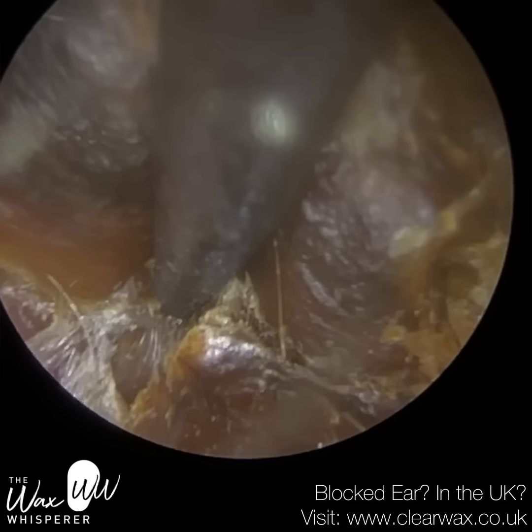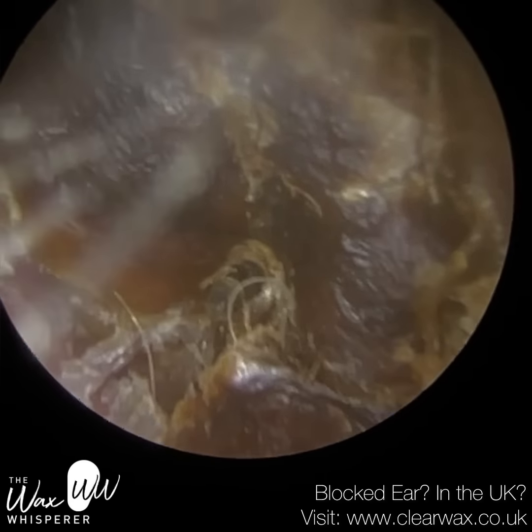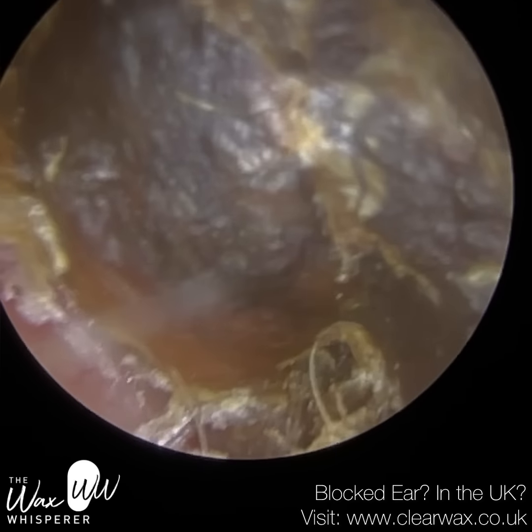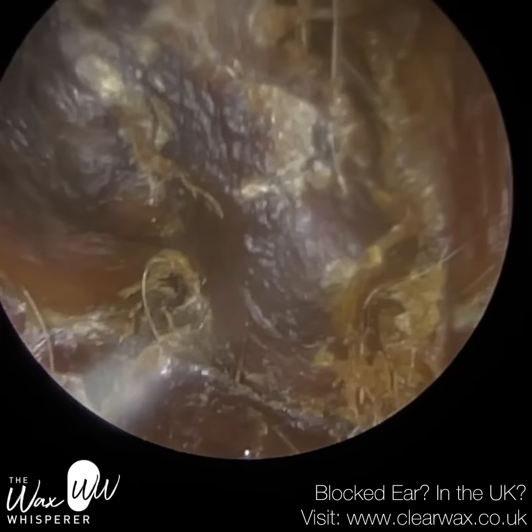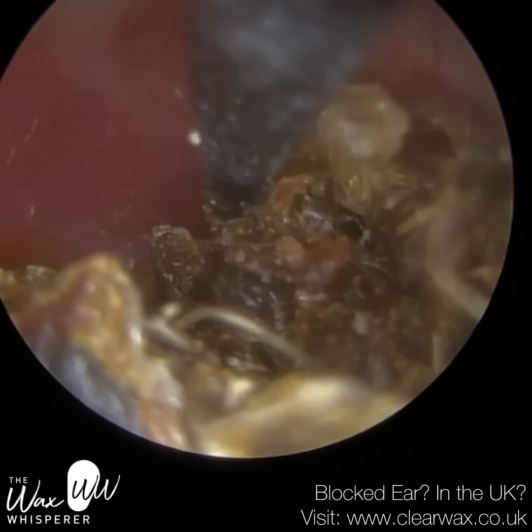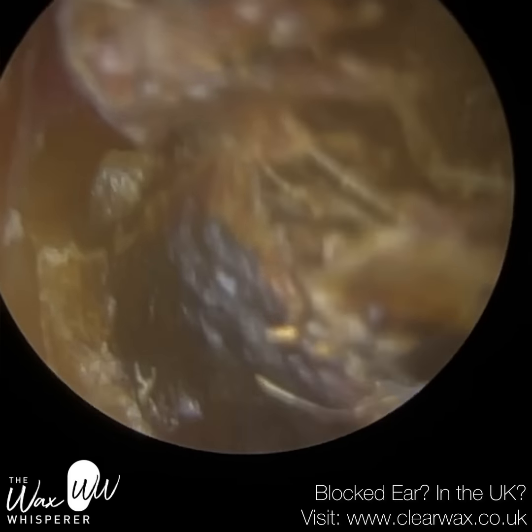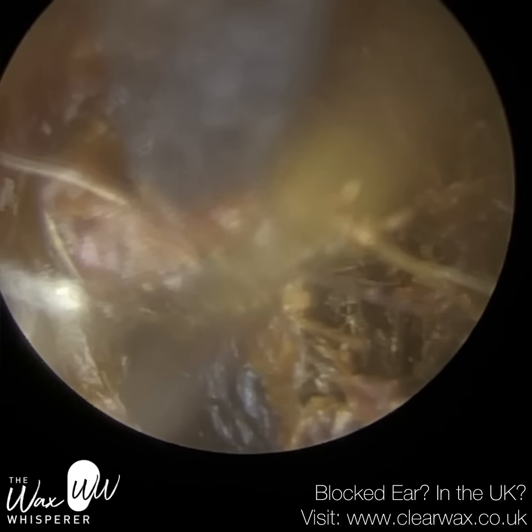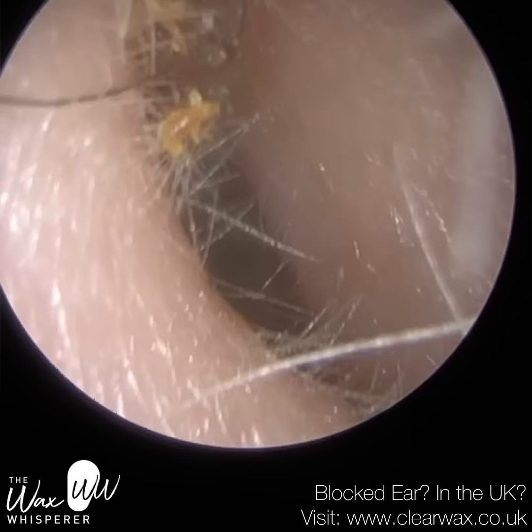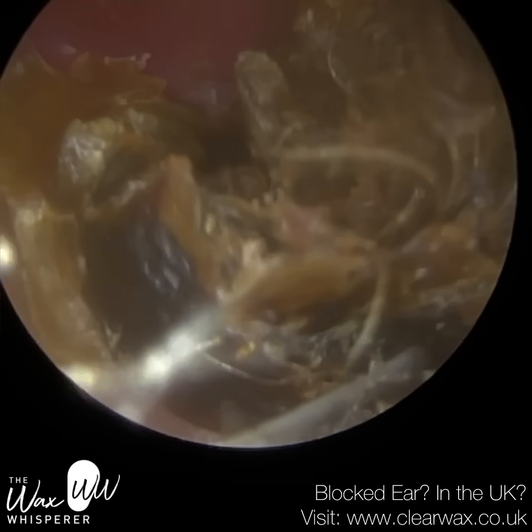But in this patient's case, this dead skin hasn't fully migrated. Instead, it's collected in a plug. And even at this stage, I'm not sure whether this is a Keratosis obturans, but there's a couple of giveaway signs. So the patient did attend with otalgia, so pain. To be diagnosed with Keratosis obturans, you must experience otalgia, so pain. Now, the roof of the ear canal isn't fully occluding, but this keratin plug extends all the way medially towards the patient's eardrum.